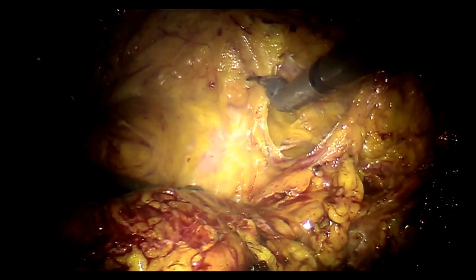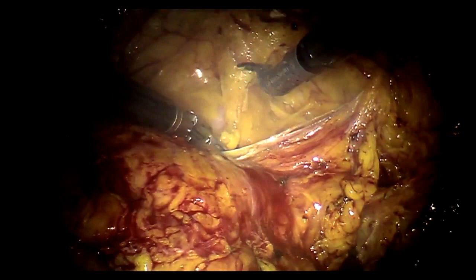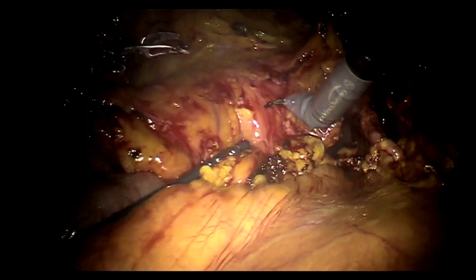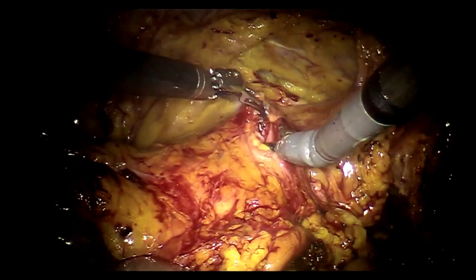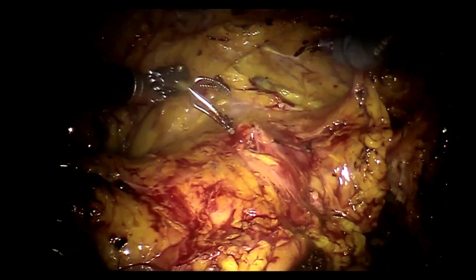This is a very thin bladder. All I was doing was retracting it, and it burst a hole. Okay, so where is that little hole? She should be anuric for 4 years, I guess. No urine for 4 years. Okay, guys, give me a quick stitch. Needle driver. Arvind, do you want to check it out?